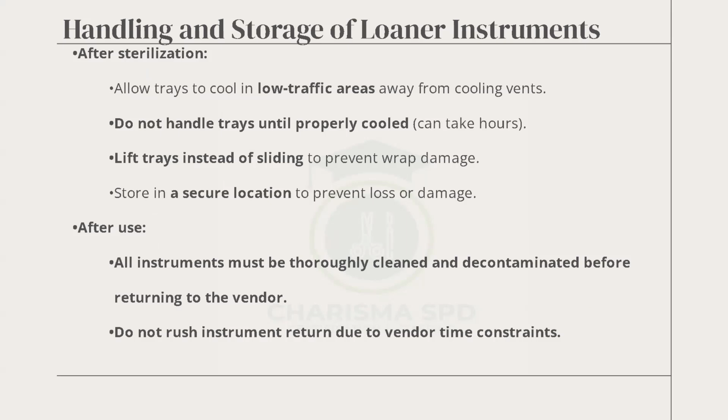Same way, with loaners, most of the time we wrap it or put it inside a container and then sterilize, after it has gone through cleaning, decontamination, and the washer. Depending on the nature of the loaner, it could be sterilized using high-level disinfectant, low temperature sterilization, or high temperature sterilization. But then it has to be stored in a place where the traffic is low, not exposed to so much traffic.